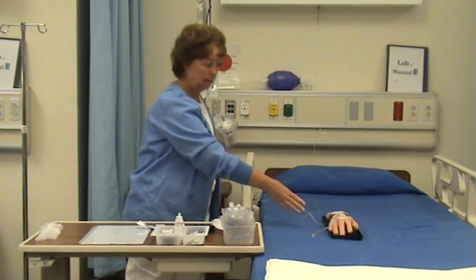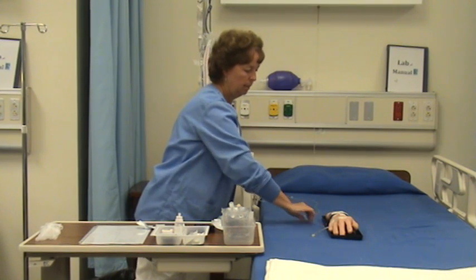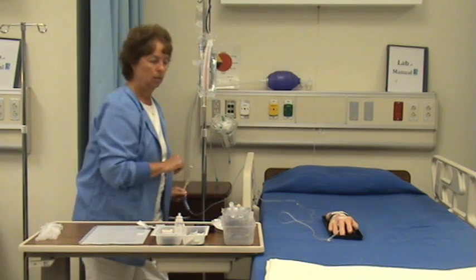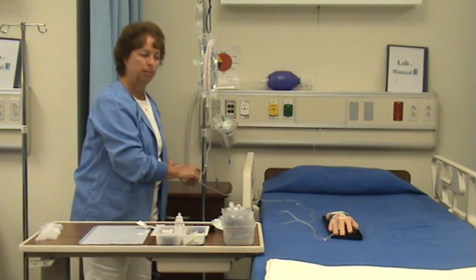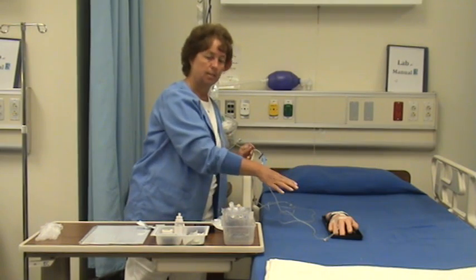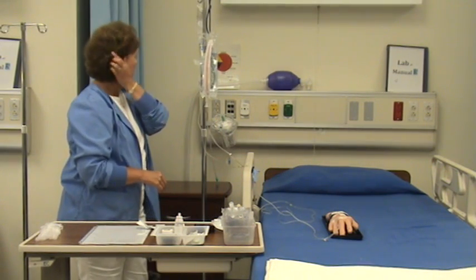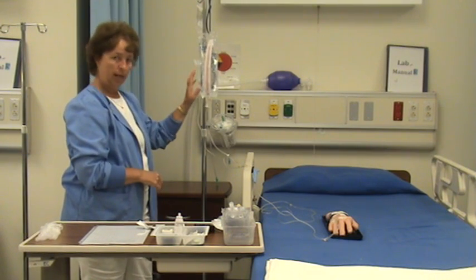I've assessed the site, made sure there's no infiltration or redness. It's not required to aspirate for a blood return, although some policies might say that, but most often it's enough just to assess the site for patency. Now this is running at 16 drops per minute. I want to reset the rate.